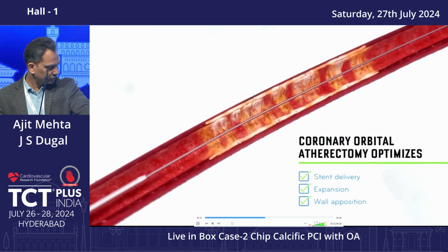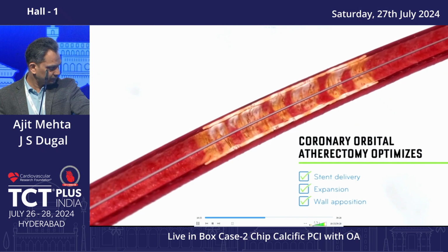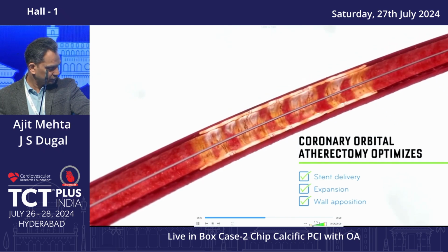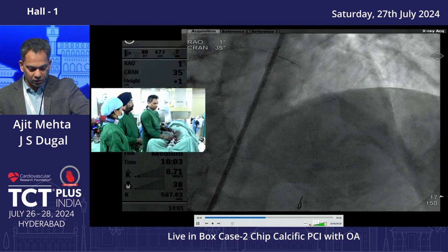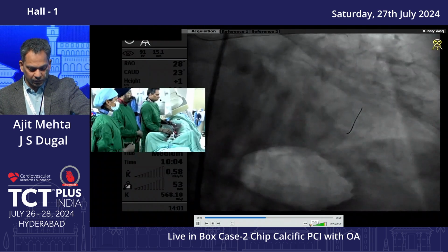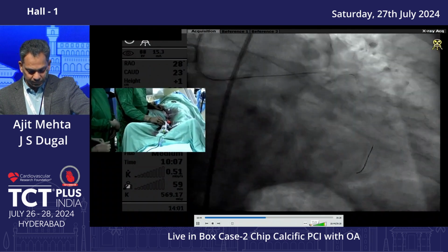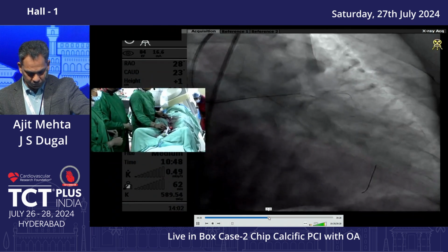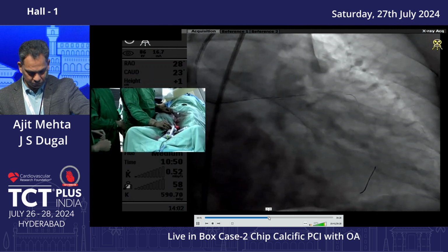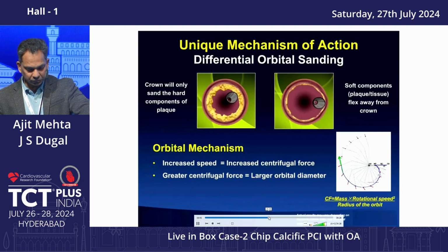And the cracking of the medial calcium is not just the device by itself; it's the device plus an NC balloon after, and your movement, that does it. At this point, what is the most important difference between doing orbital and rotational atherectomy?